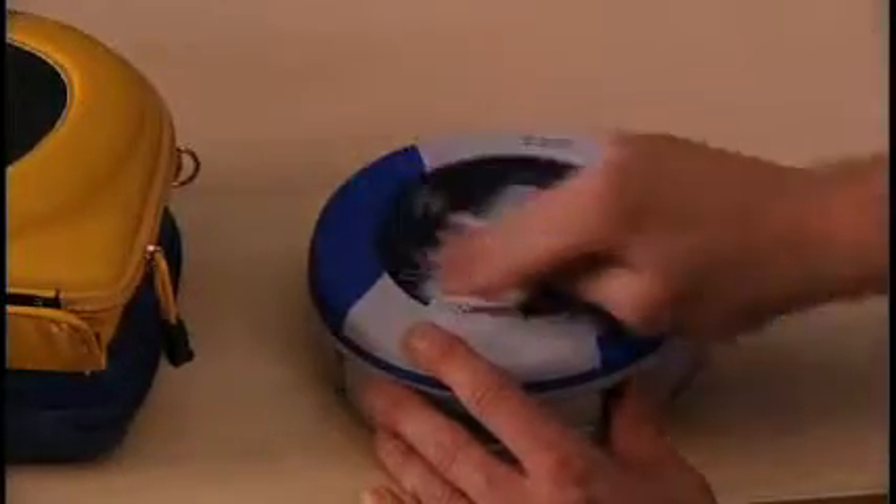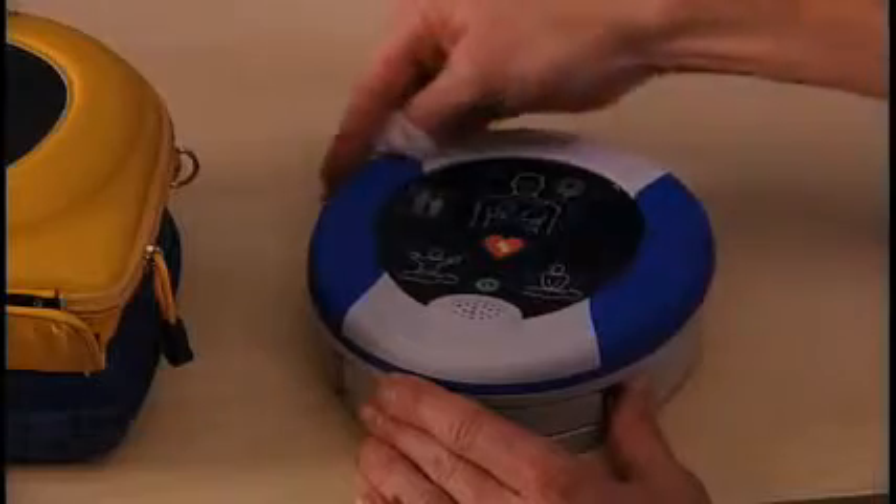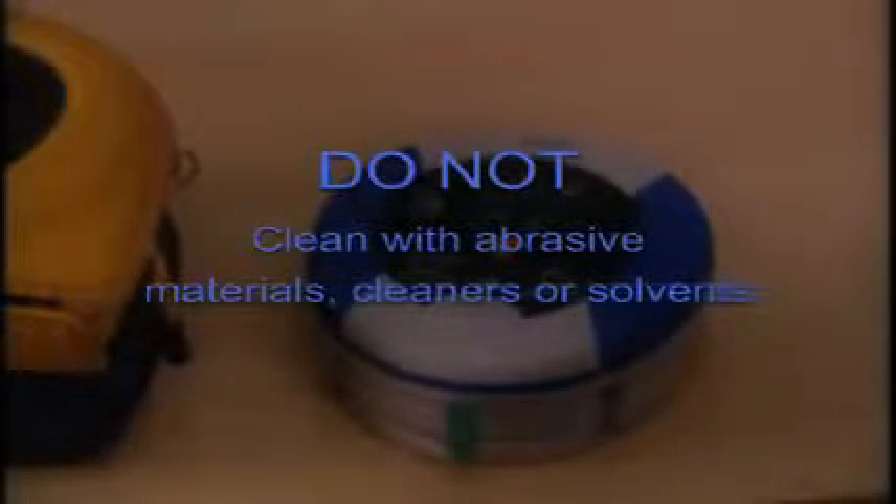To clean the Samaritan PAD, wipe the device with a soft cloth that has been dampened with either soapy water or isopropyl alcohol. Do not immerse the PAD in water or any type of fluid. Do not clean the Samaritan PAD with abrasive materials, cleaners, or solvents.